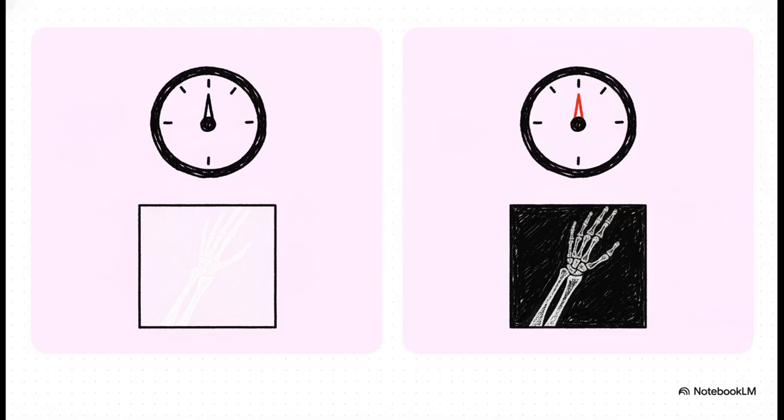The primary technical causes of these density faults come straight down to the machine's settings. If your MAS or KVP, which, by the way, dictate the total number and penetrating power of the X-rays, are too low, you get underexposure. If those settings are too high, you guessed it, you get overexposure. It's a really delicate balancing act.